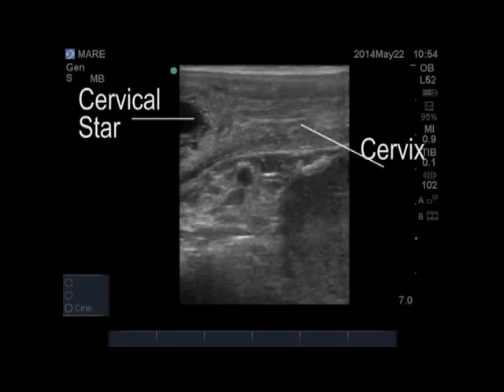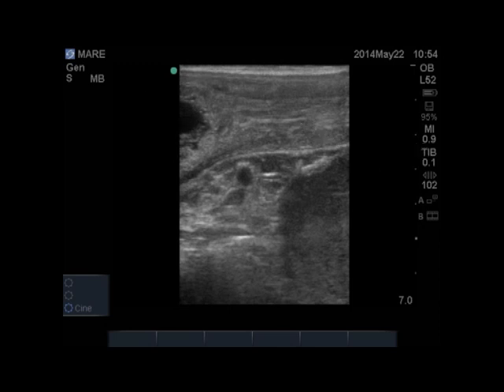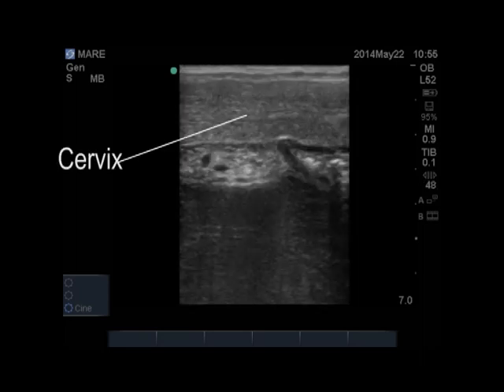Here we're just moving backwards, and we can see the cervical star, where the foal emerges from through the placenta — it breaks this area — and a nice tight cervix beside that. Moving further back from the mare, a nice, healthy, tight, pregnant cervix.